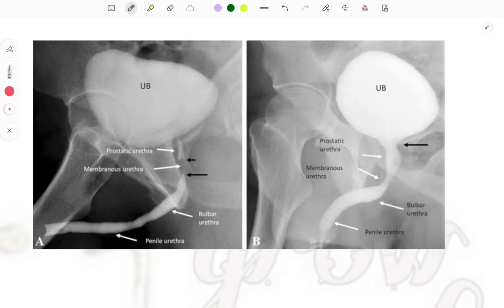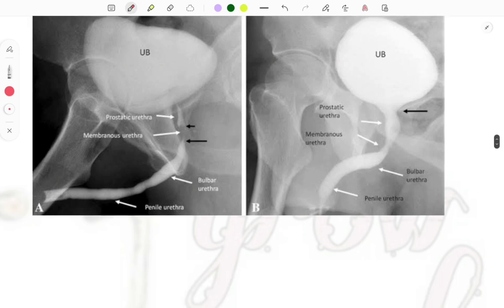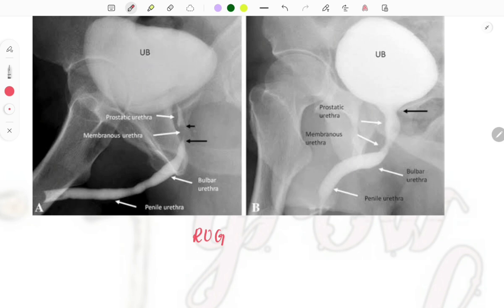This is a retrourethrogram — a repeat image asked multiple times. They will mark structures and ask you to identify them. You can see the urinary bladder with contrast filled, then the prostatic urethra, the membranous urethra, the bulbar urethra, and the penile urethra. Similar images from different angles may also be asked.